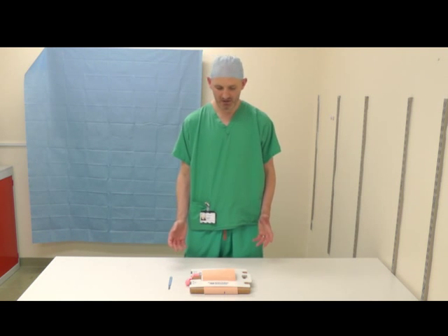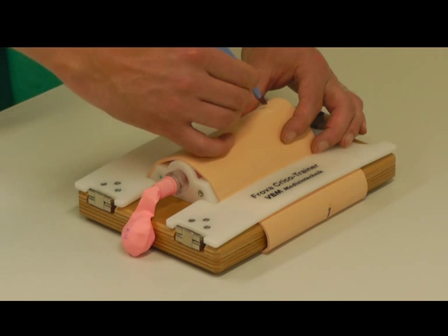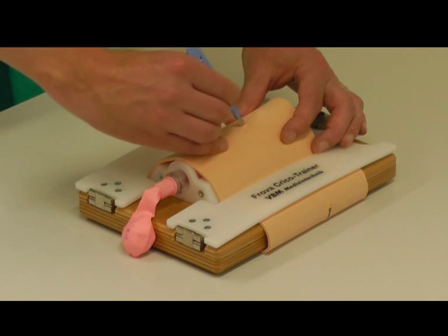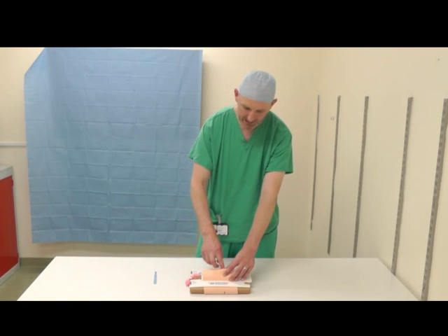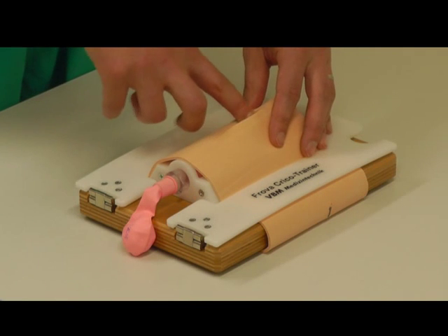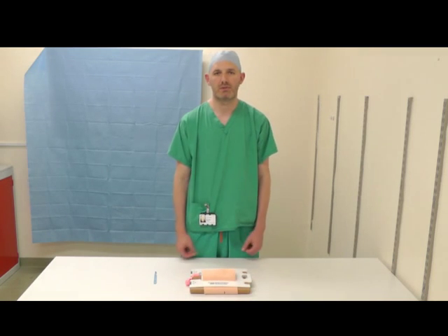So in the obese patient, you may not be able to palpate the landmarks. So in this scenario, you need to do a large midline incision through the skin and subcutaneous tissue, and then palpate the landmarks of the thyroid and the cricoid cartilage, and then proceed as we've demonstrated before.